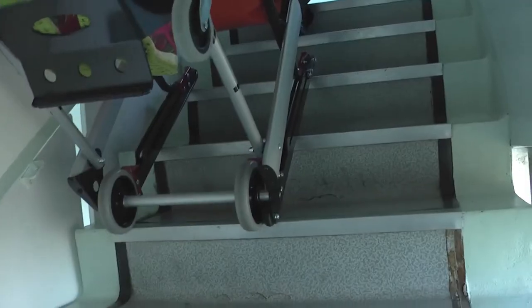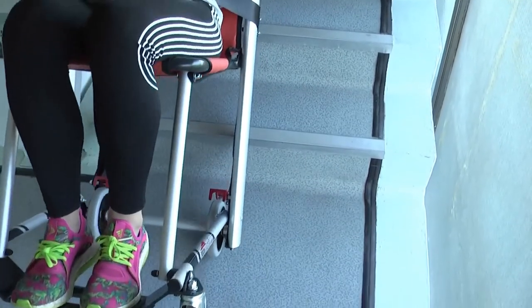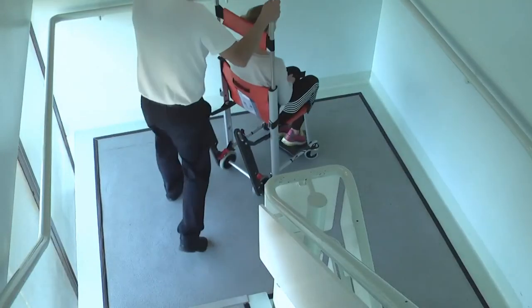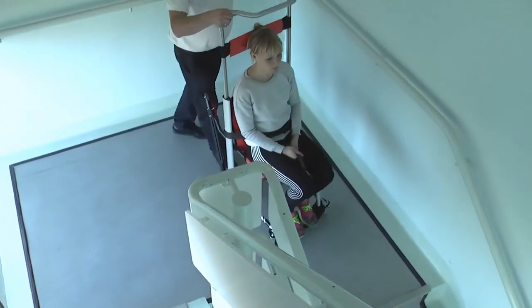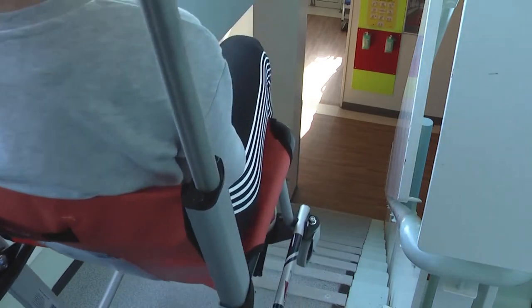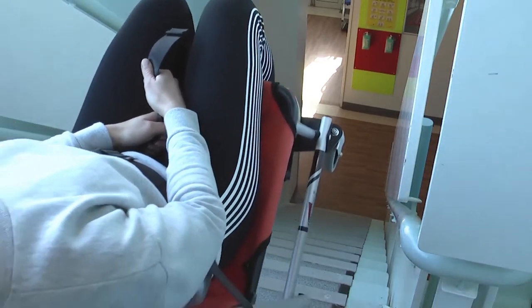Gently tilt the chair backwards on its back wheels and push the chair over the top step until the unique stair blade track system connects with the stairs. Firmly push down on the telescopic handle to navigate down the stairs to the half landing. Once the back wheels touch the landing, tilt the chair forwards until it is travelling on all four wheels and proceed forwards. Steer a wide course on the half landing and repeat the process until you reach the ground floor or safe area.